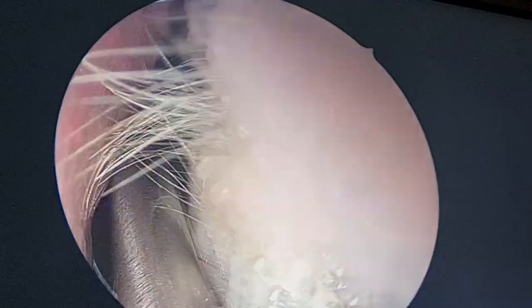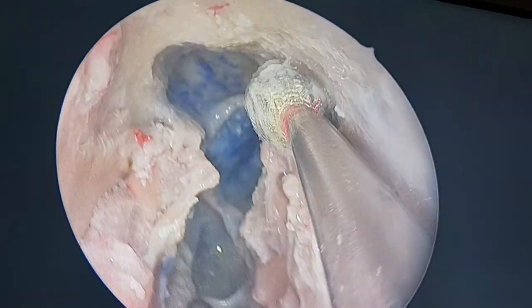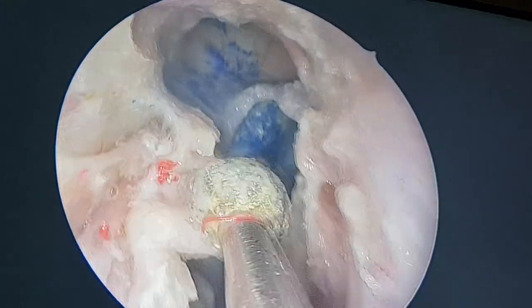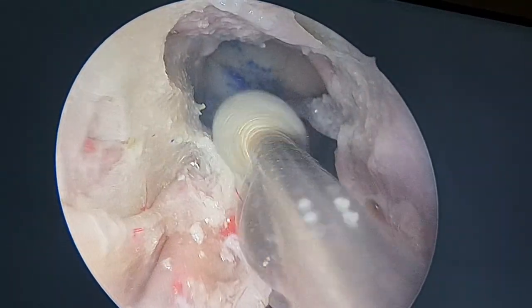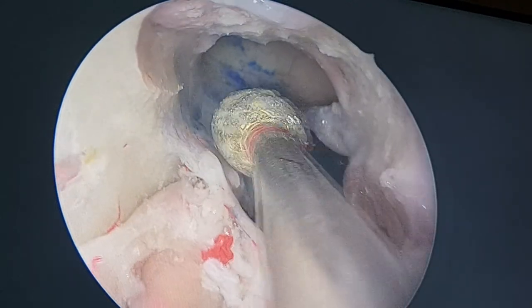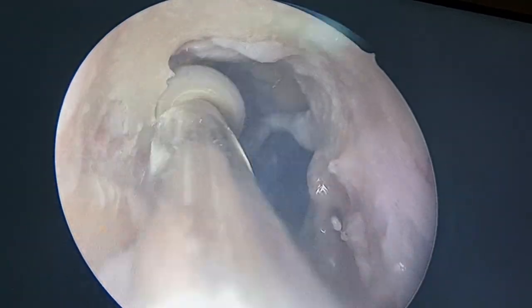So now, last few minutes left. See now. This is the skin. Now anteriorly you can widen it further. How much anteriorly, how much medially? See my first olfactory neuron here left behind. So keeping that I can widen it more inferiorly. See this? Leaving a thin bone over the first olfactory neuron. This is my posterior limit now. Medial limit, I can go up to the inter sinus septa.